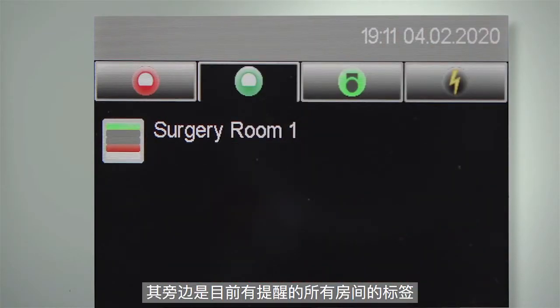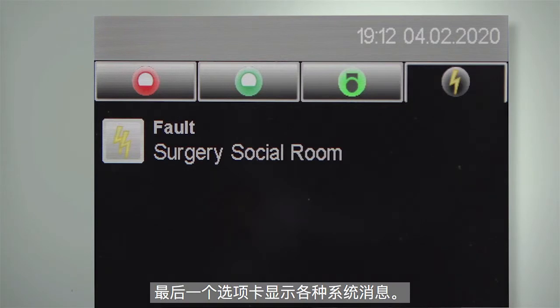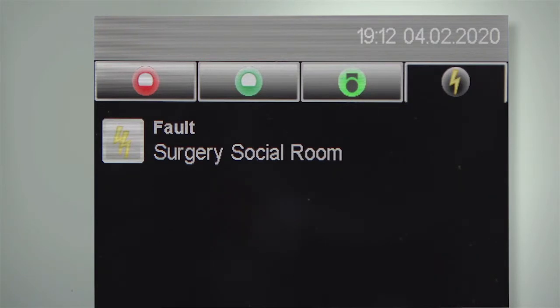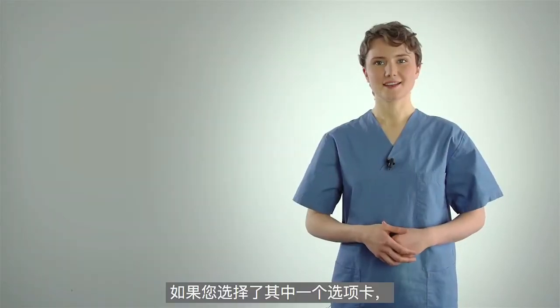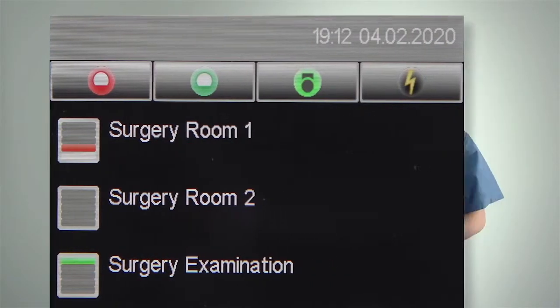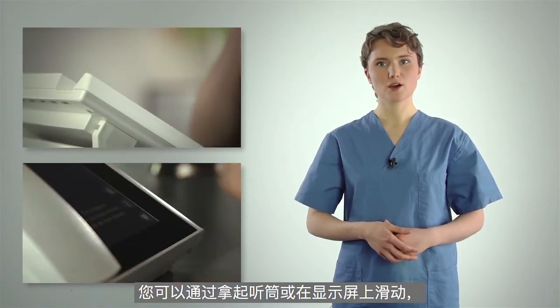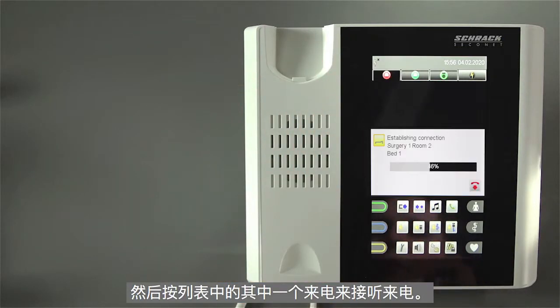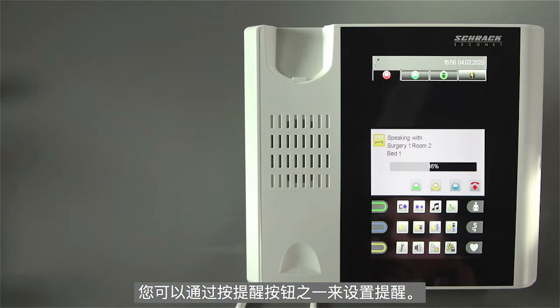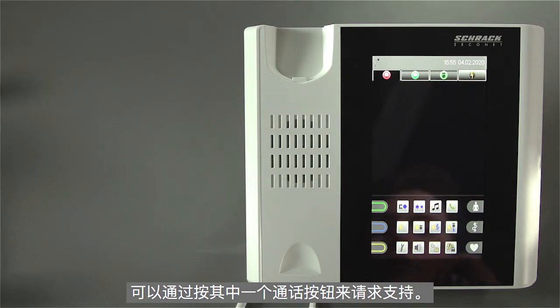Next to the call list is the tab for all rooms that currently have reminders. To the right is the tab for all rooms with set presences. The last tab displays various system messages. If you have selected one of the tabs, you can access the complete room list by pressing the tab again. You can take incoming calls by lifting the handset or swiping across the display and then pressing one of the incoming calls on the list. You can set a reminder by pressing one of the reminder buttons. Support can be requested by pressing one of the call buttons.